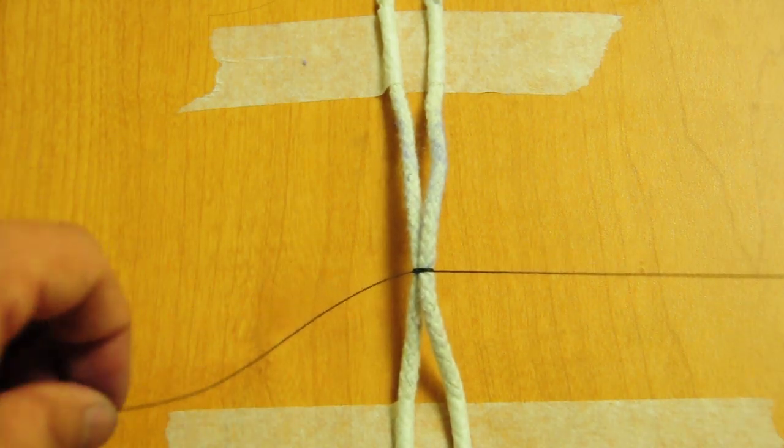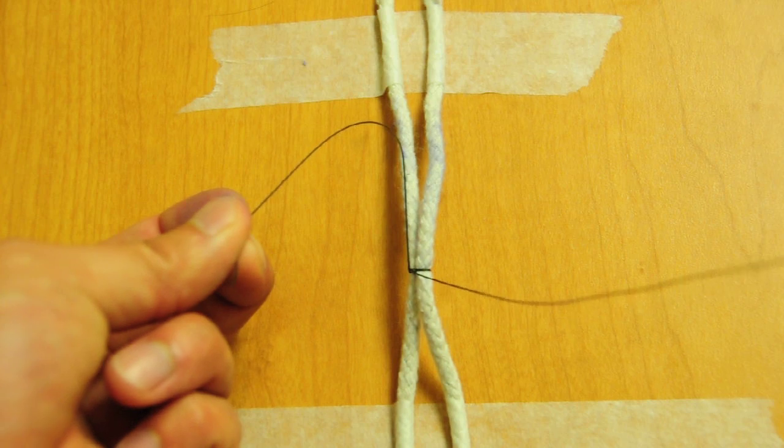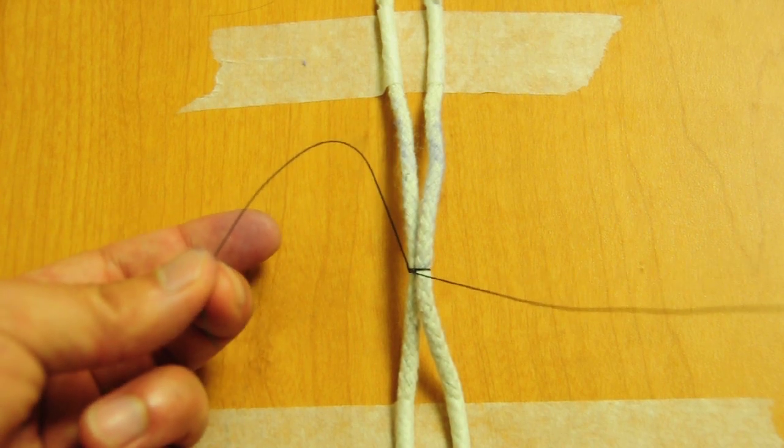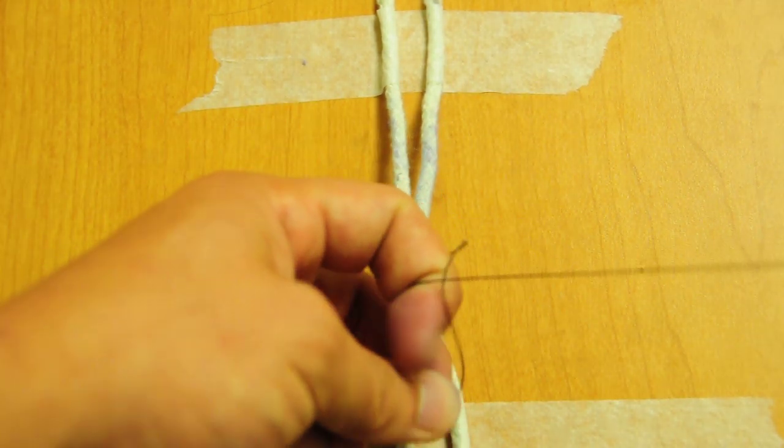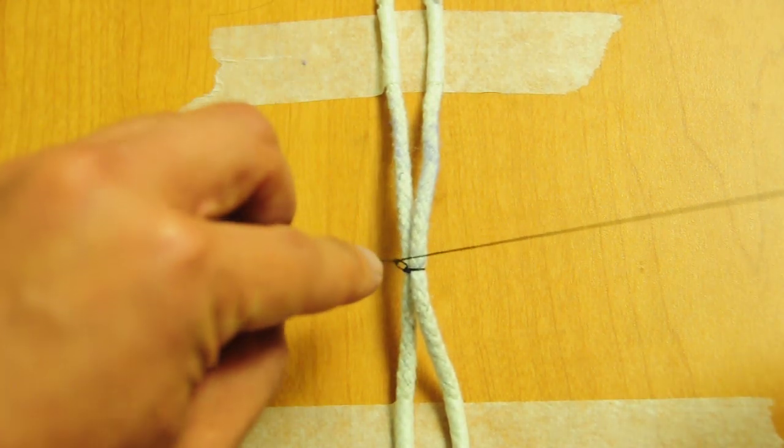Same thing. Back to the index finger. Make the loop over your index finger. I'm holding it with my index finger and thumb. Sorry, I'm holding it with my middle finger and thumb, making the loop over the index finger. Your index finger is going to grab across. And then you can sense it down nice and flat.